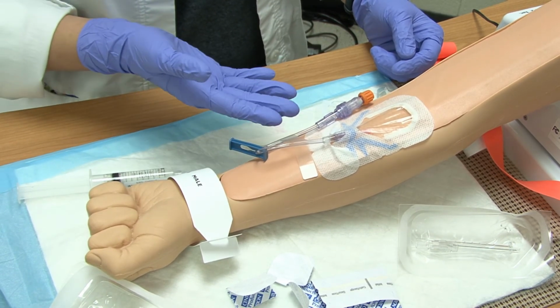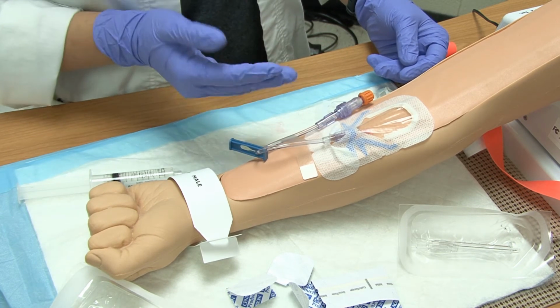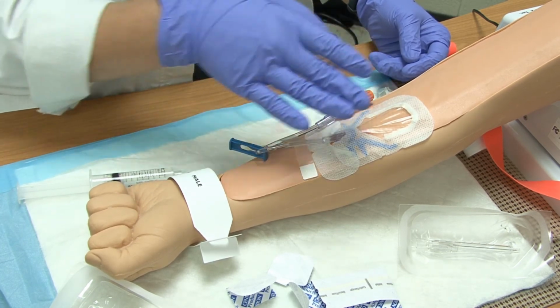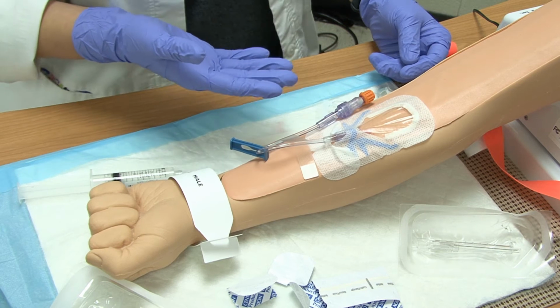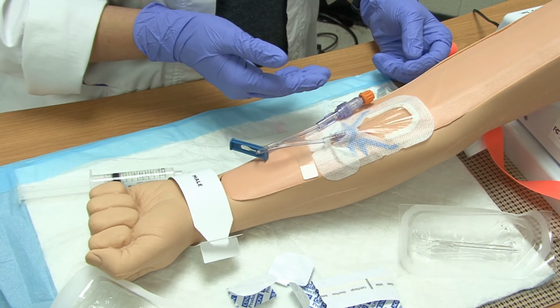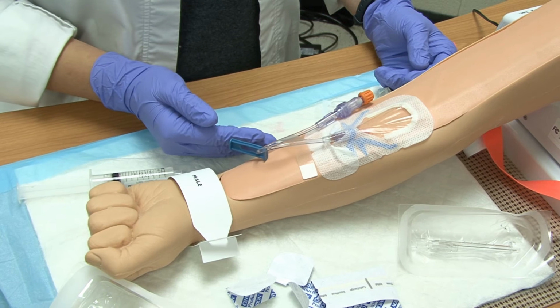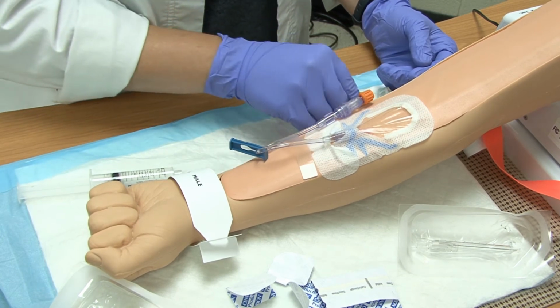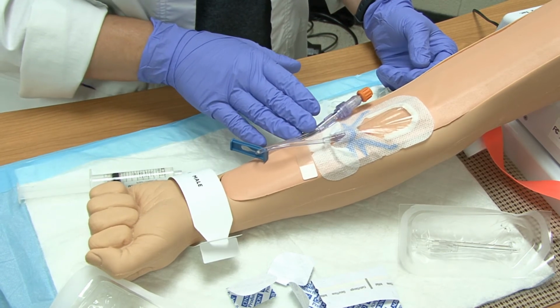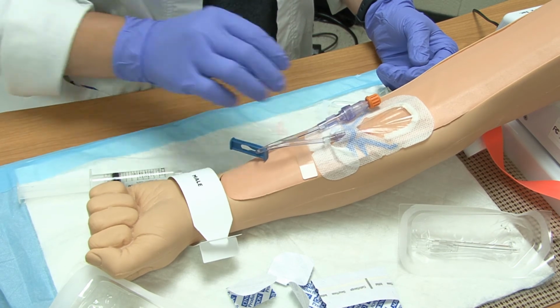Certainly anytime you come in and assess the IV, you should always be flushing it, because the only way you can state that your IV is patent is by actually flushing it and making sure that you have blood return, that it flushes well, and that there's no swelling or irritation at the site. So we've discussed how to assess your patient's veins, find an appropriate site, do the insertion, and assess a site. And as we said, anytime before you use the saline lock, you always want to flush it and assess for patency.